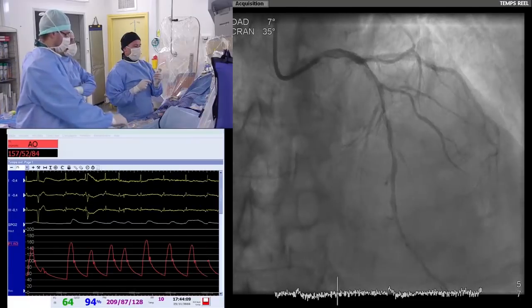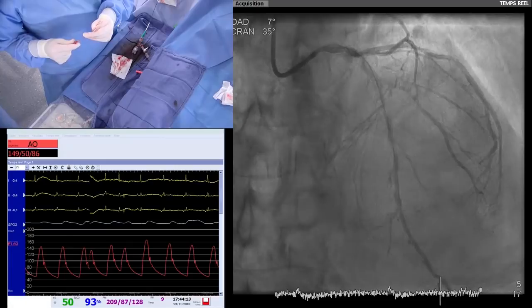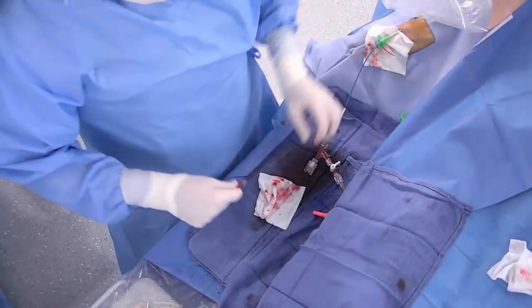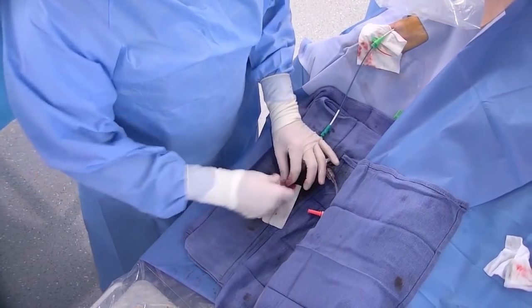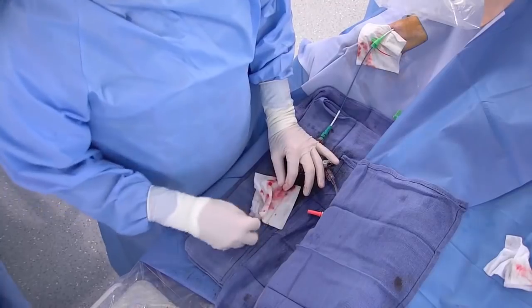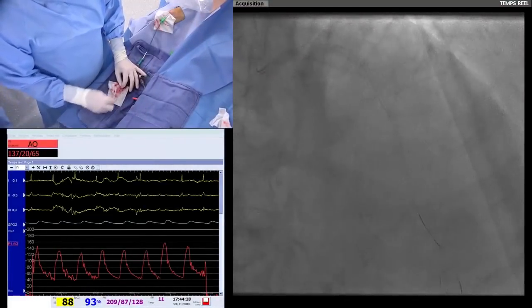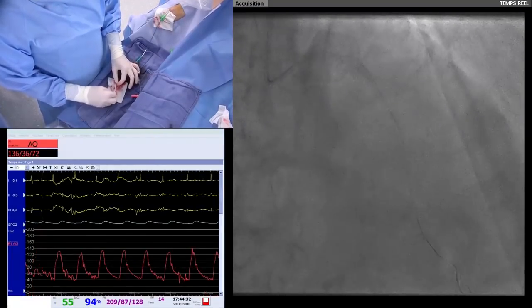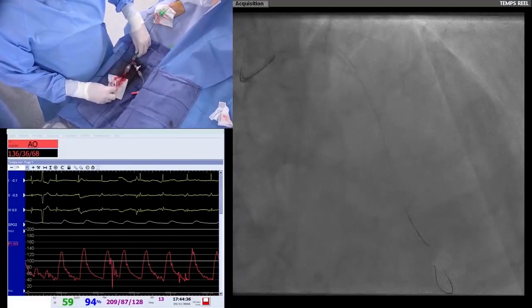We need to discuss whether to stent first the LAD and then proceed to the dilatation of the left main, or complete the dilatation all the way through and then start stenting. It's something we can discuss together. But I would use non-compliant balloon. That's my personal preference. I know that other colleagues might prefer cutting or scoring balloon at this time, or even semi-compliant balloon. It's a matter of preference. My personal preference would be, having seen the amount of calcium, to use non-compliant balloons.